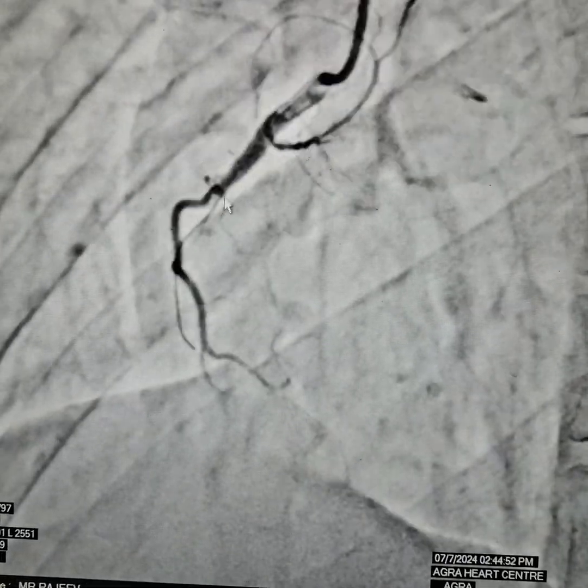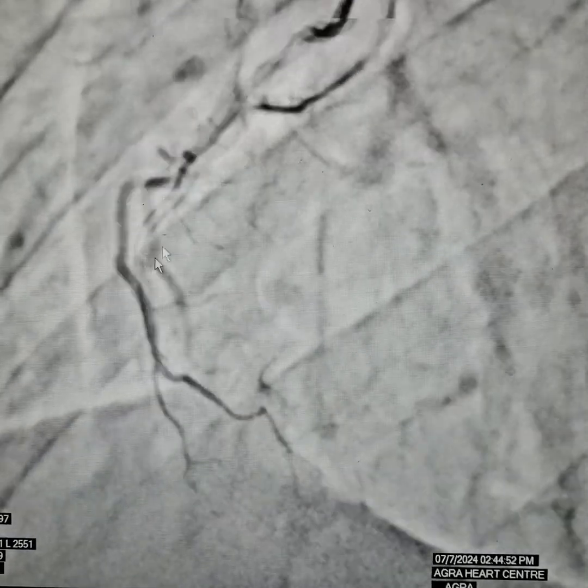After we have already crossed the lesion here, we know that we are in the right track. We have crossed and as you can see, we are in the right track. Knowledge or estimation is very important. You can see that we are in the right track.